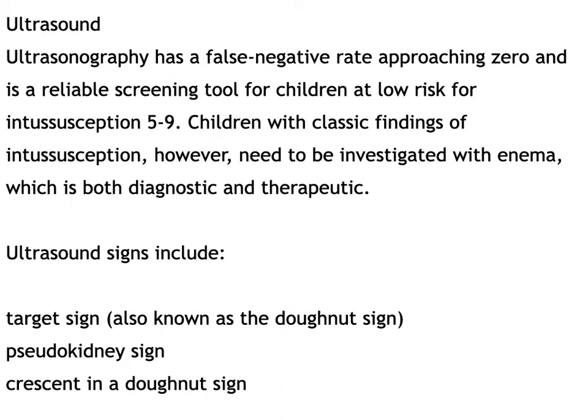The gold standard for the diagnosis of intussusception is ultrasound. The sensitivity and specificity are higher than for appendicitis, very close to 100%. I can say it's 100%. That depends on the operator, on the experience of who is doing the ultrasound, but in the hands of an experienced sonographer or radiologist, it is 100%.